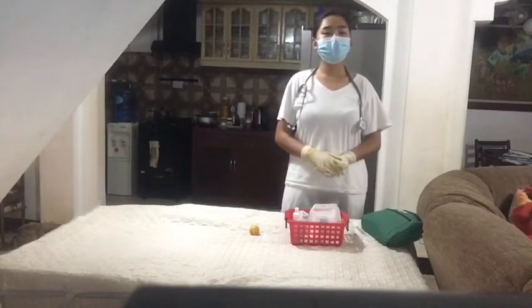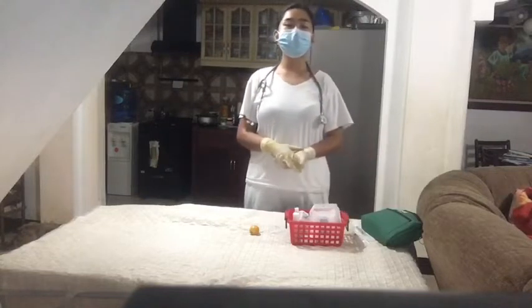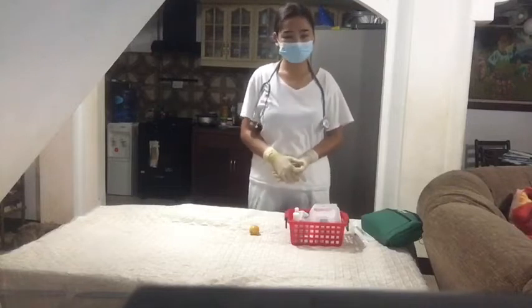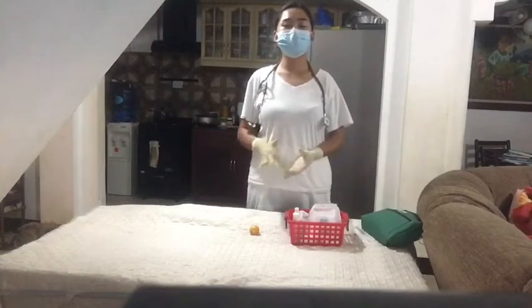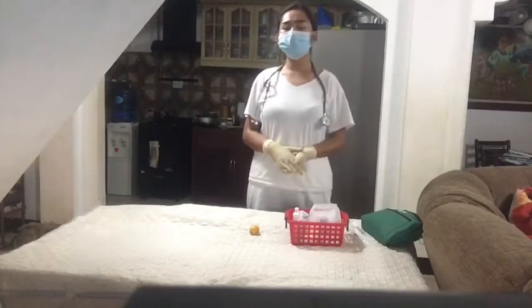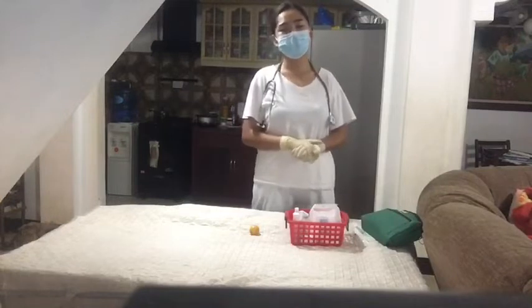Prepare the medication from the vial or ampule for drug withdrawal. Organization of necessary procedure facilitates accurate skill performance. The next step is to provide privacy. Provide privacy by shutting the curtains. This will make the client or the patient feel comfortable.